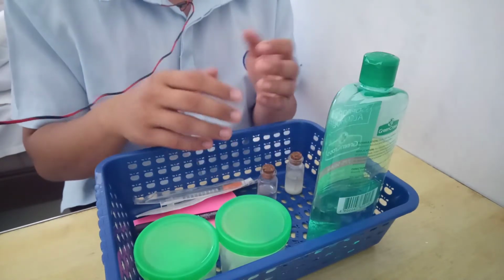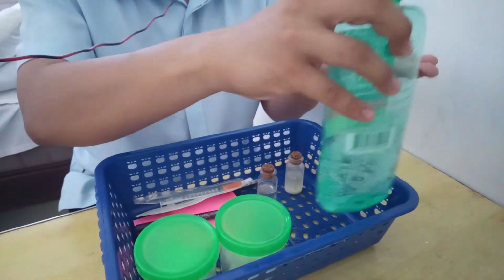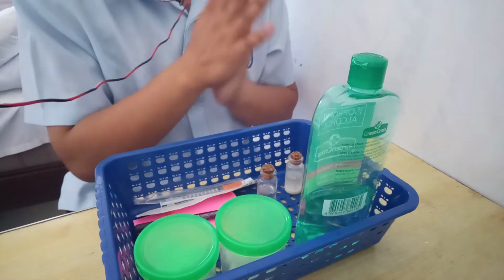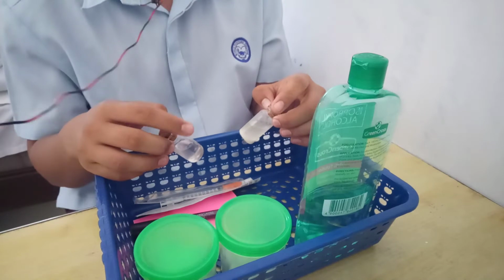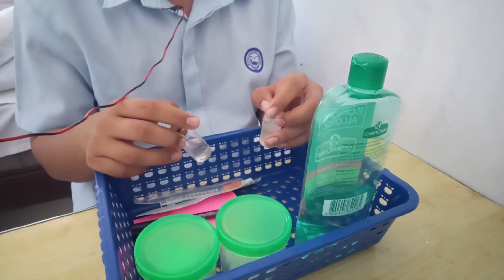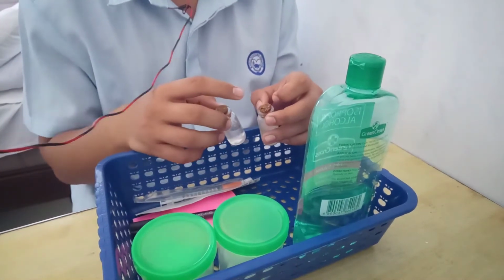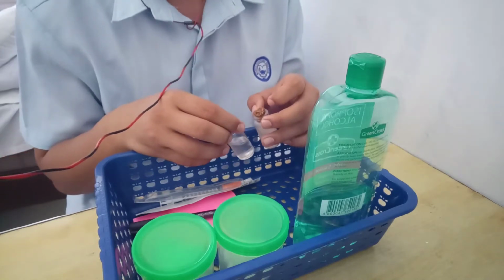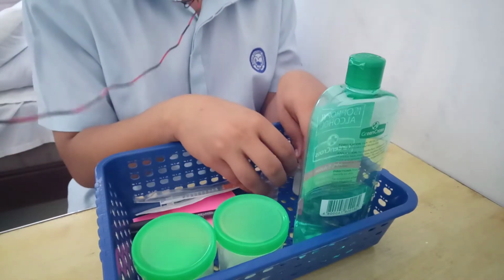After that is wash hands and dry them. So we will use alcohol. After washing hands, remove the cap that protects the rubber stopper of each vial. Since we improvise our insulin vials, the original one has its own cap and rubber stopper. So let's assume that the cap is already removed for both vials.